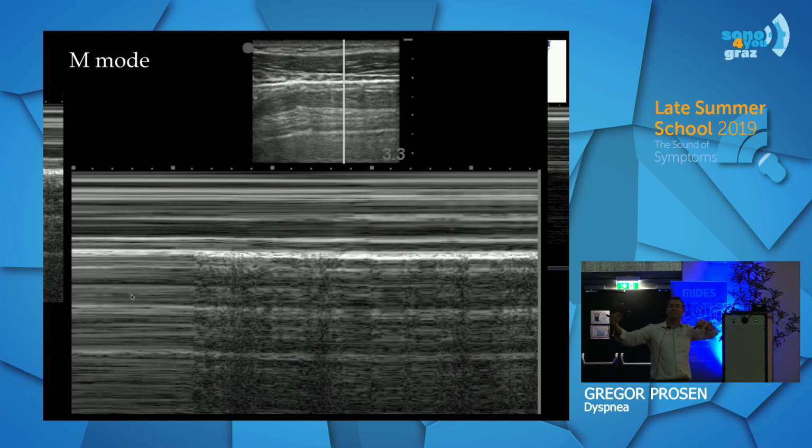But where was this pneumothorax? How big was it? Can you say that from this image? Can you tell? No, because this lung point might be here, or might be here, or might be here, and the pneumothorax was so big, or so big, or so big. Okay? It tells you nothing about the patient. It just tells you the fact there was lung coming in, going out, in, out. Okay? So you have to be, again, doctors first and sonographers second.